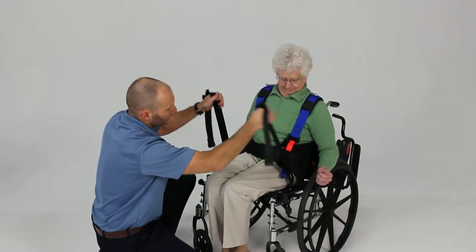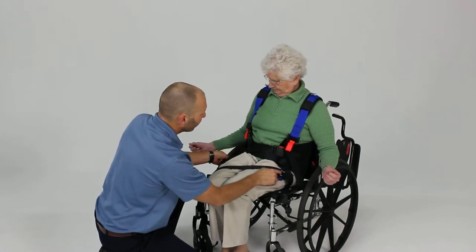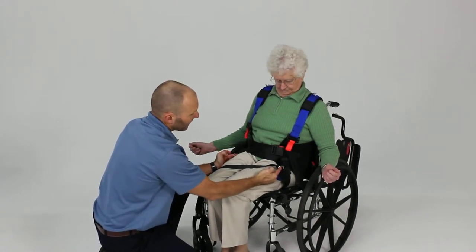Now that we've got that tucked underneath the hips, we can make sure it's centered by checking the position of the two D-rings on each side. Looks like we've got that nice and centered.